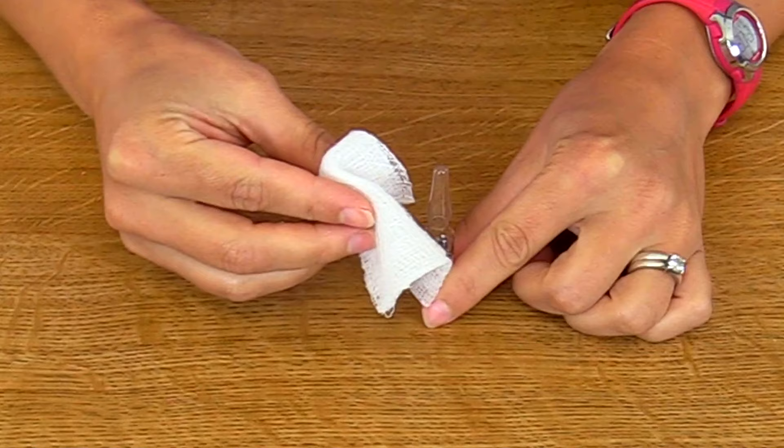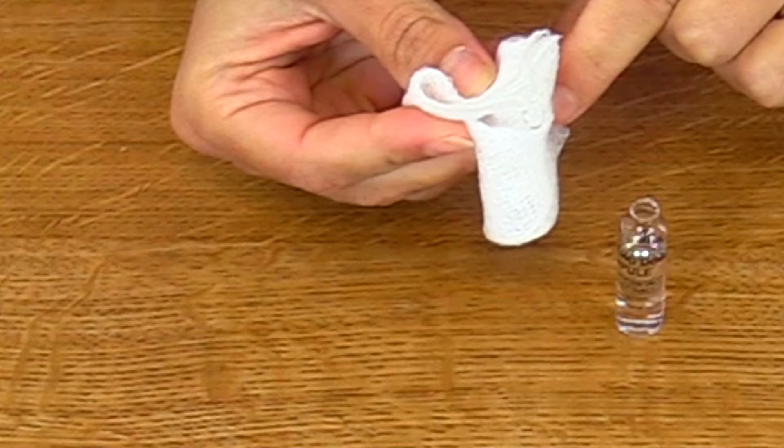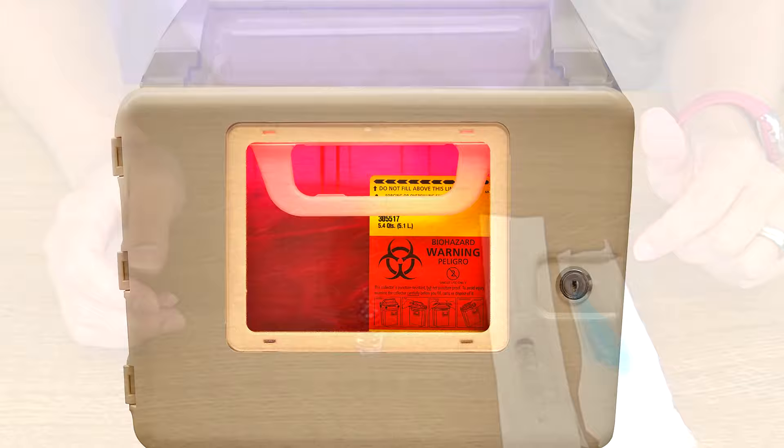So here we go — wrap it around the head and neck and just snap it off. You will have a broken piece of the head and neck, and you want to throw this in the sharps container and throw away your gauze. Now we're going to withdraw the medication out of the ampule.